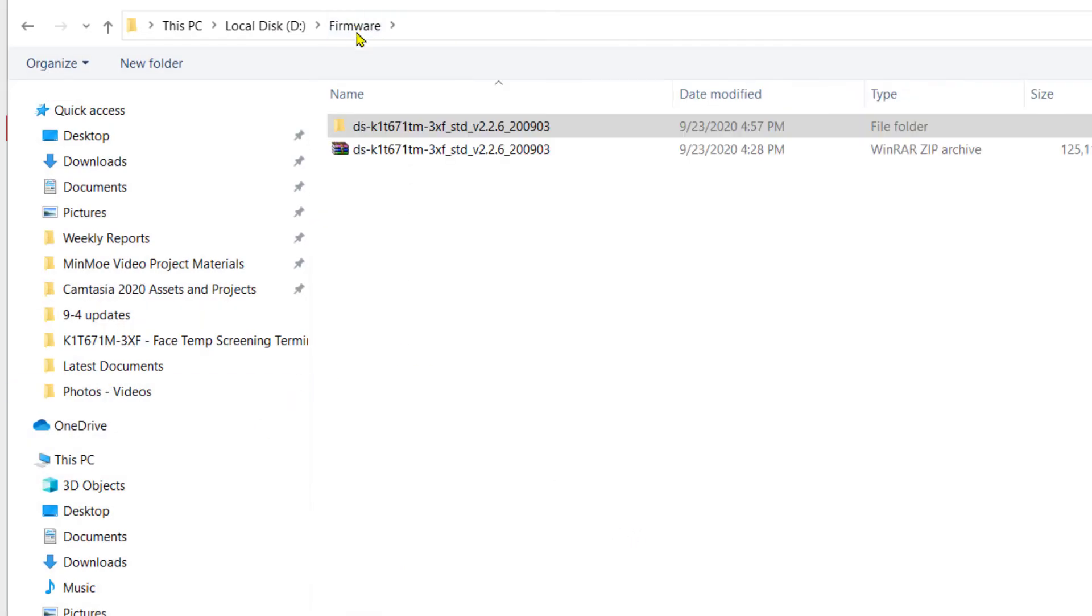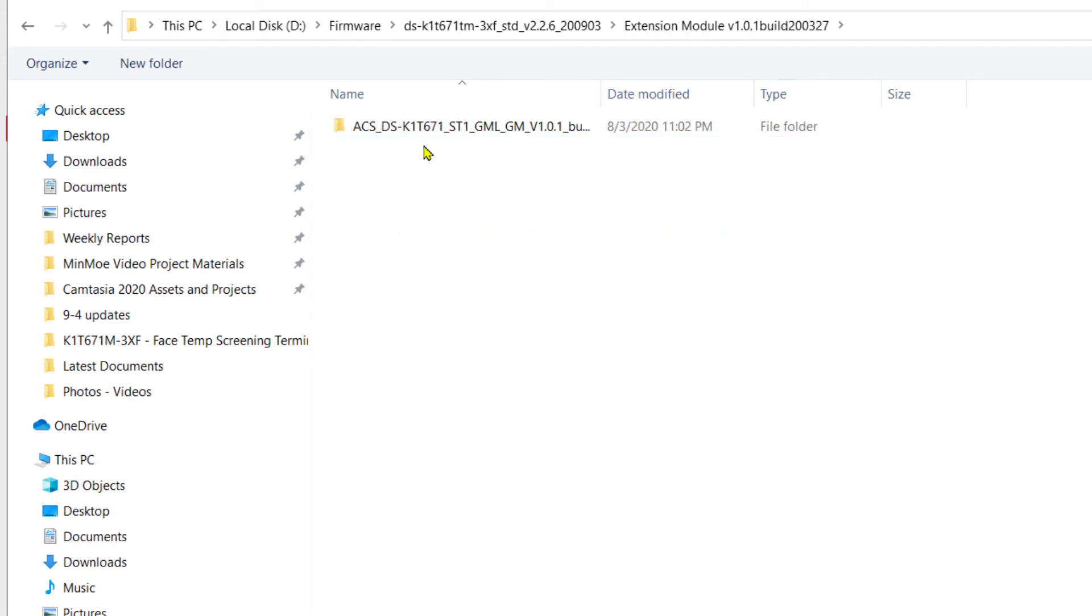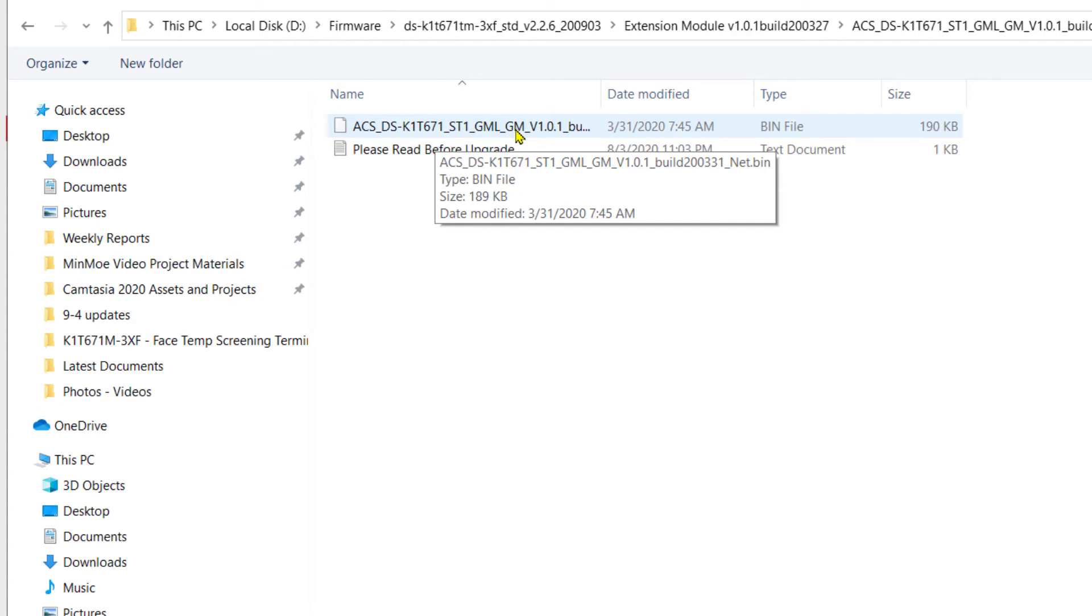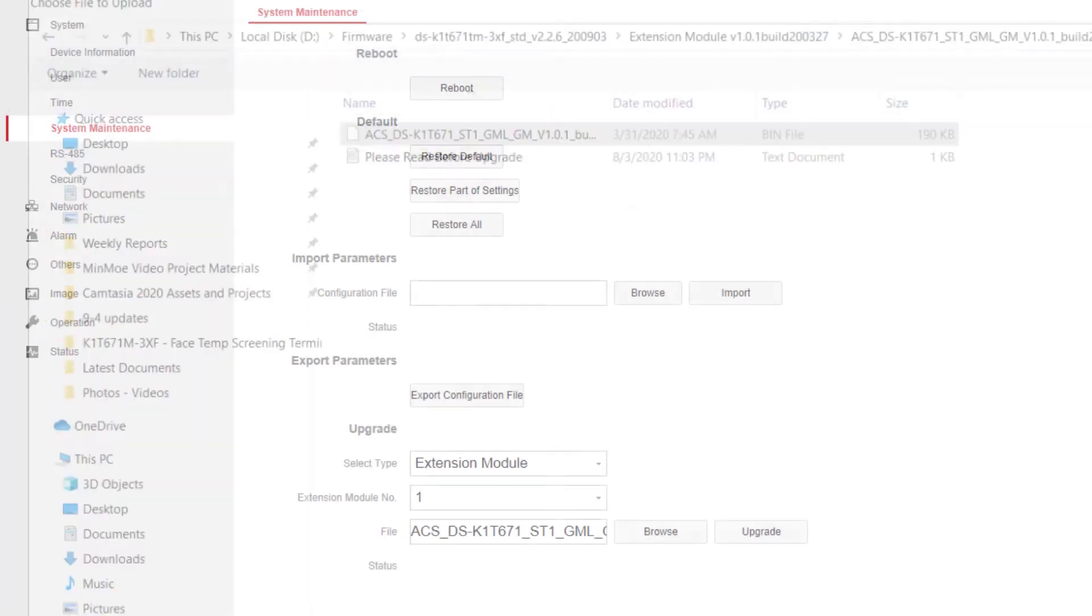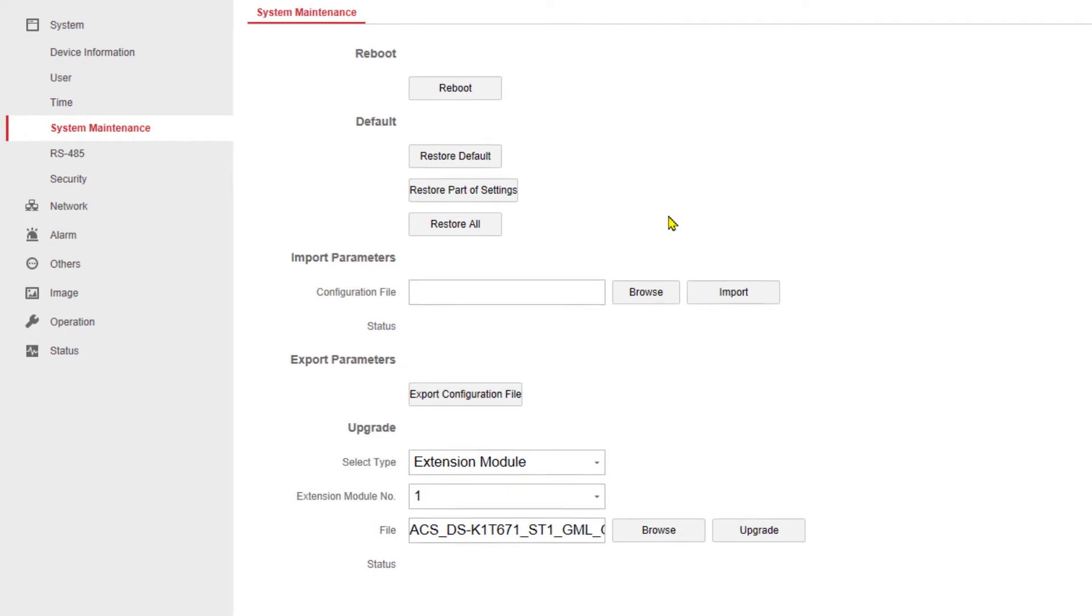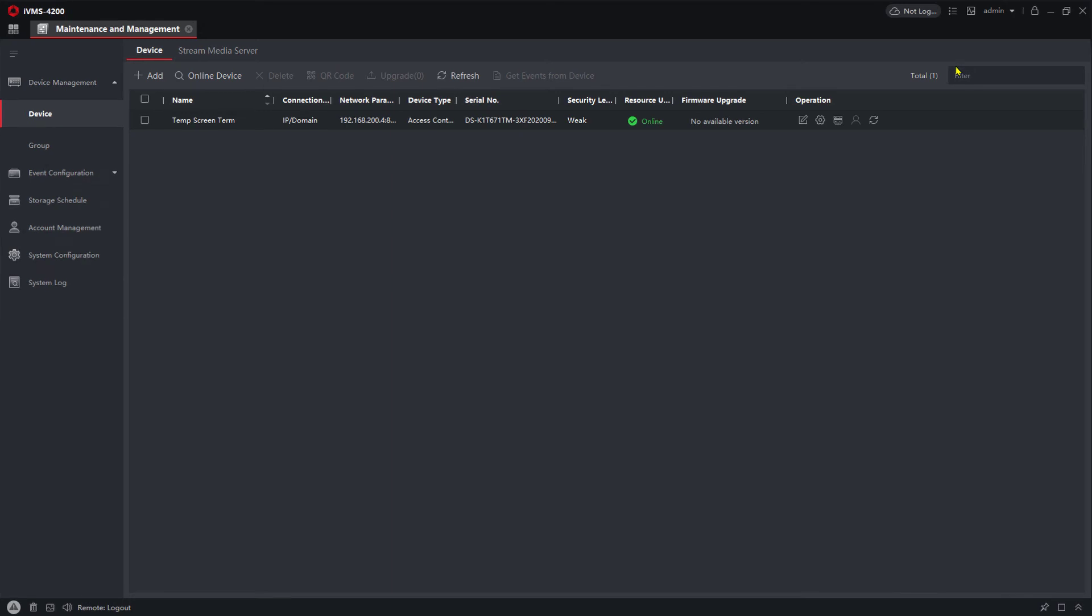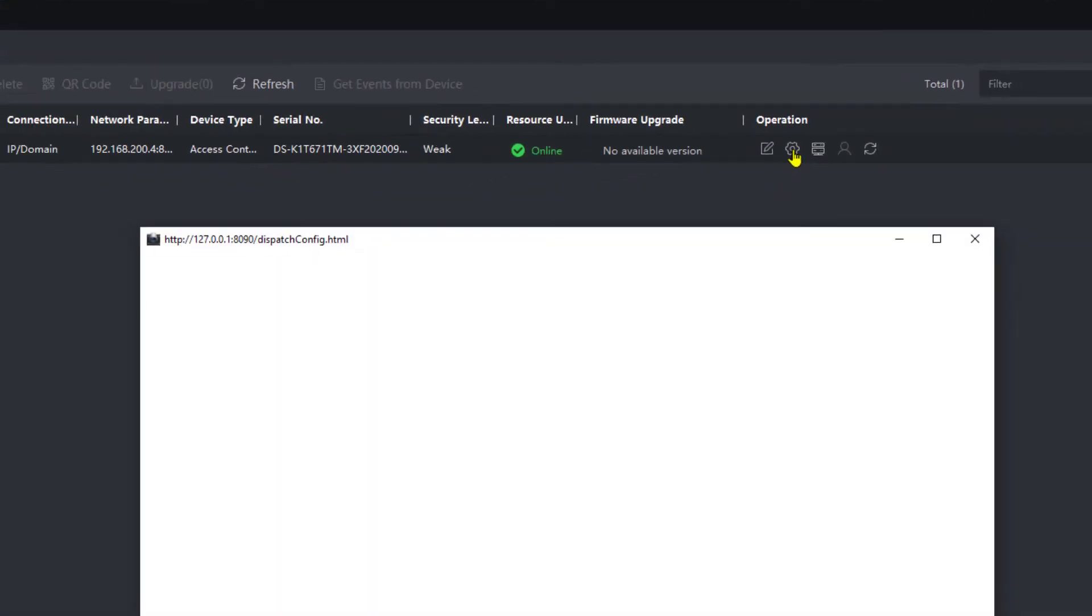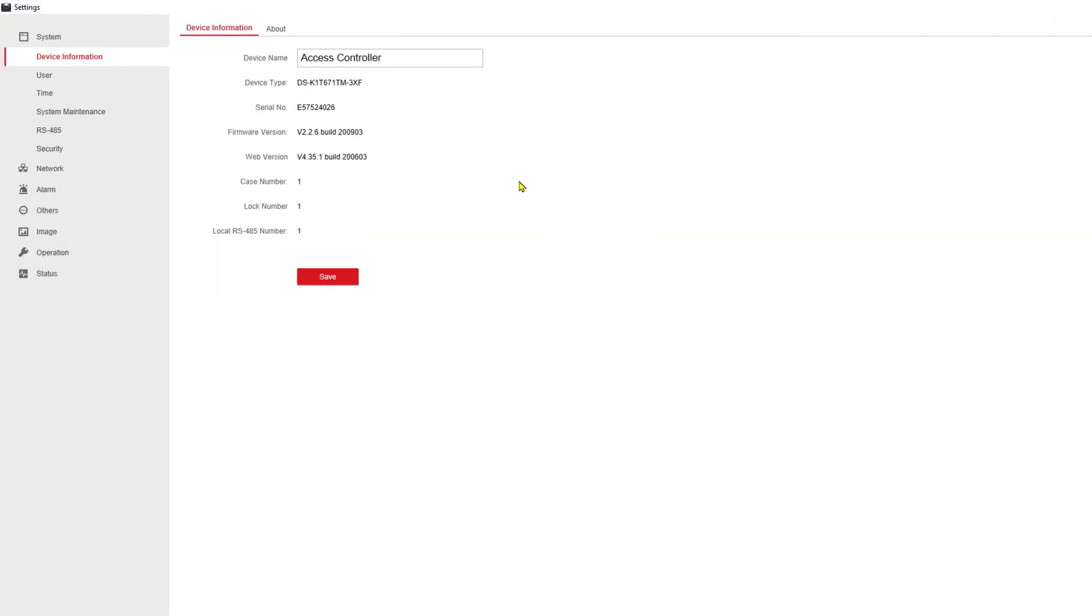I'm going to go back to the firmware folder and find the extension module folder, and inside of that folder is a subfolder, and inside of that is a bin file. So I'm going to choose that bin file and I'm going to click on upgrade. And again, the process will start the upgrade and eventually it will disconnect from the device and tell you so.